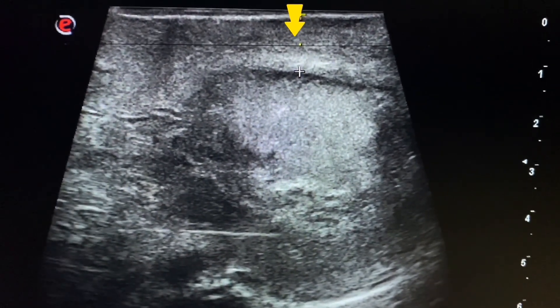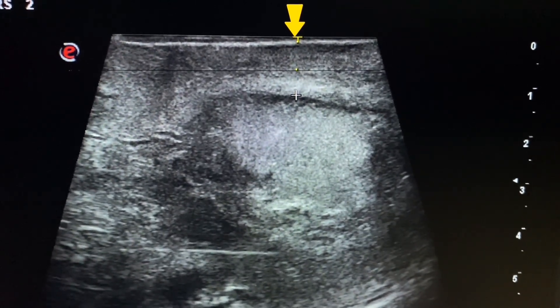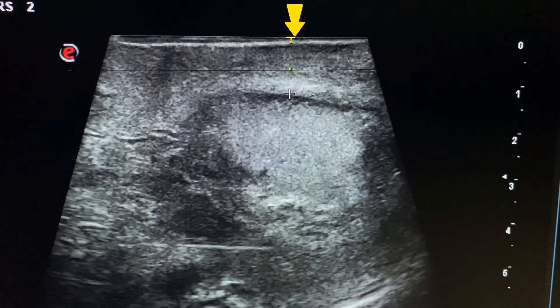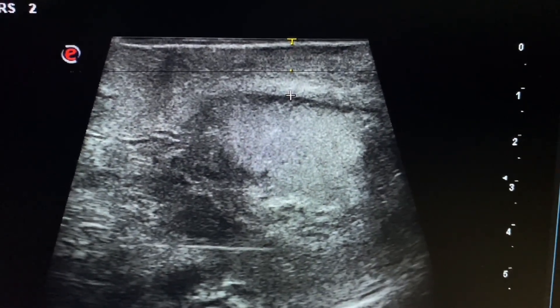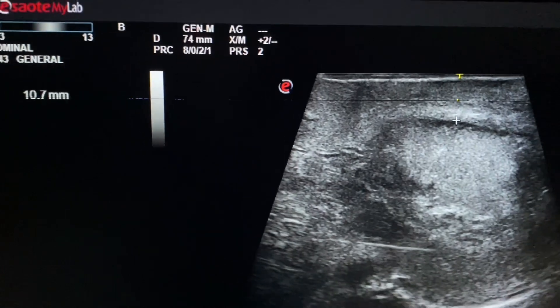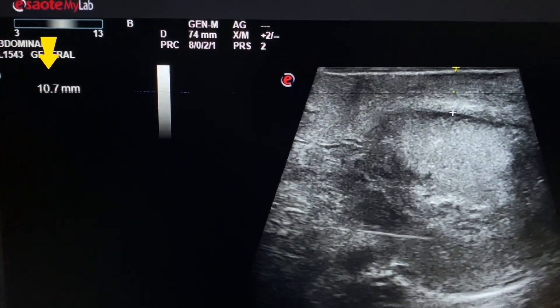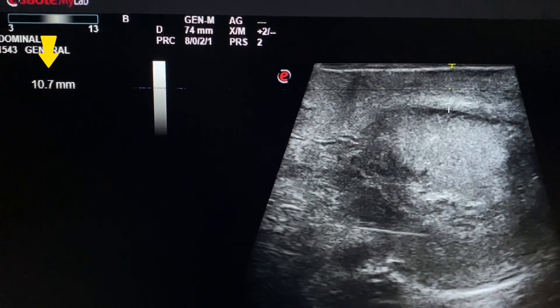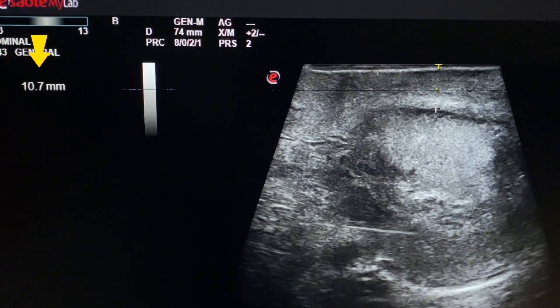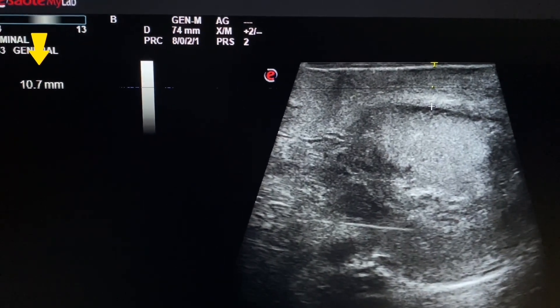The scrotal skin is also thickened and shows heterogeneous texture. The size of the scrotal skin is 10.7 mm, which indicates inflammation. The normal size of scrotal skin is up to 6 mm.